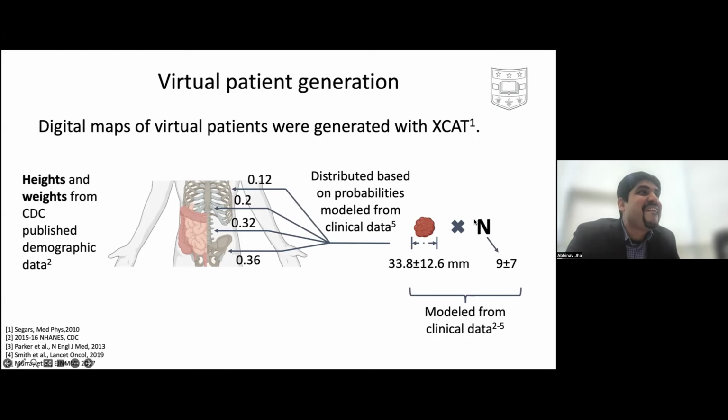How do you differentiate between failed insertion and the computation? Some of these cases are right, there are computational errors. We have the XCAT phantom. Sometimes the tumor is too large, and you're trying to put that in the bone, and then it does not look like a real tumor anymore, because the tumor is large and the bone is this small. So you do go through every individual patient.